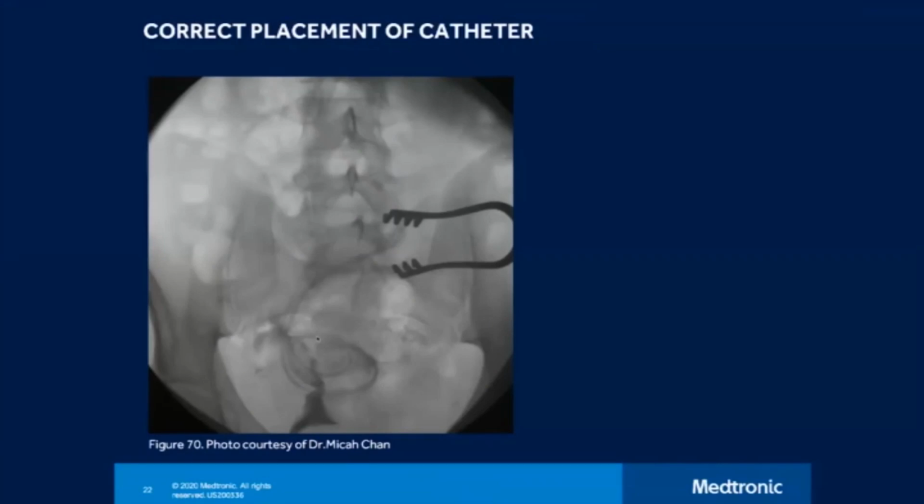And again, I recommend doing a purse string, and usually we use 2.0 Vicryl, usually CT, it's a little better bite. And we just do 3 bites, a purse string over the catheter there. And then you do prevent a pericatheter leak by doing that. So you can't just throw in a pigtail catheter like for a drainage without cutting down to the rectus sheath because there's risk for infection, etc.